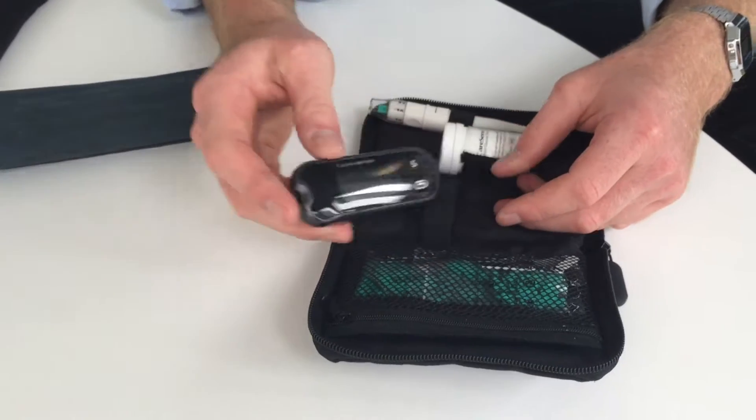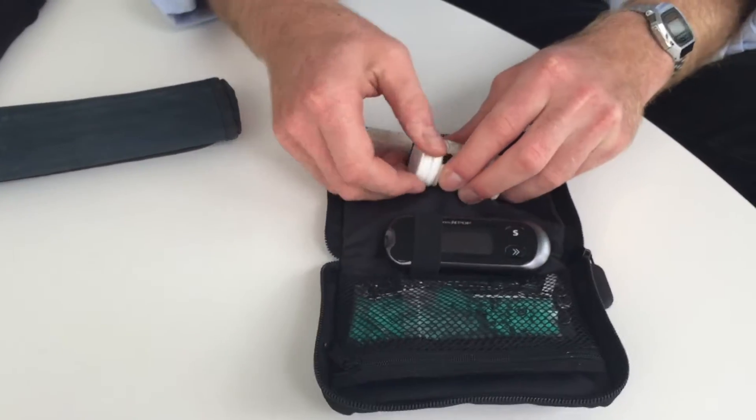I have type 1 diabetes. It means that my pancreas doesn't produce any insulin. I manage it by using two things. A glucose testing kit, which allows me to prick my finger, get a blood sample, and then it tests the amount of blood glucose in the bloodstream.